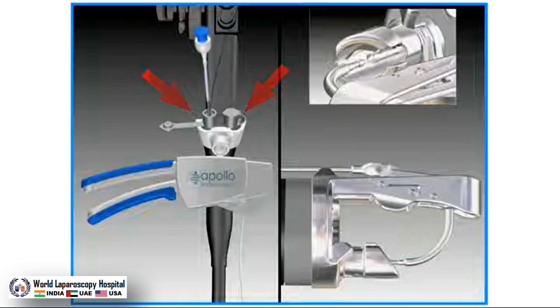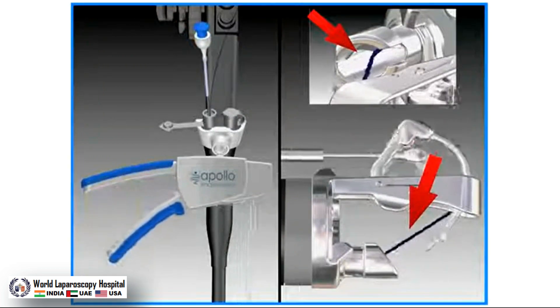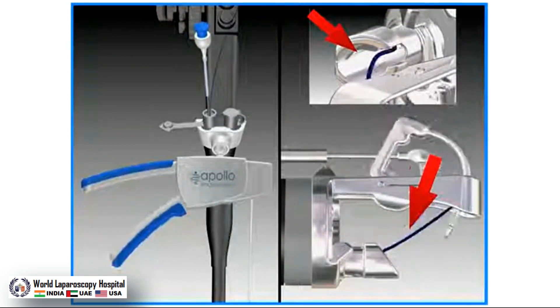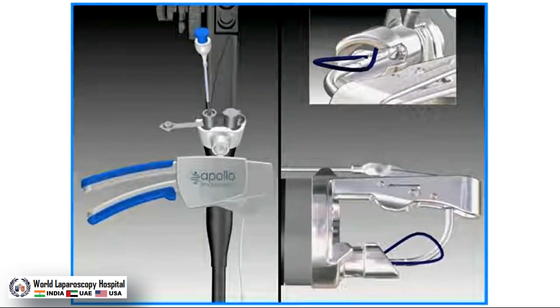This disposable system attaches to a dual-channel Olympus endoscope. The OverStitch system is based upon shuttling a needle between the anchor exchange and the curved needle body. The needle is first loaded onto the curved needle body, after which the device is ready to take a stitch.